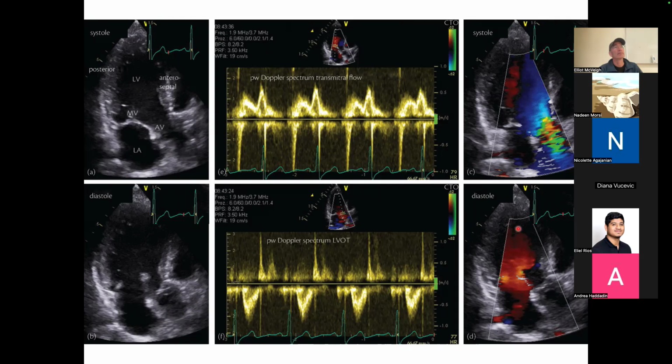If they're eating an apple and then they'll show something lights up on them, is it the same thing? Is it because of the velocity? Are you talking about functional MR? Yeah. Okay. So the question is, is this color map the same as a functional MRI color map? Yeah, okay. Those are two different physical phenomena.